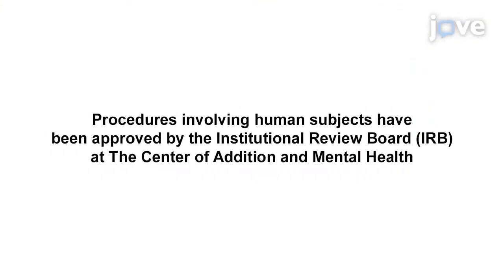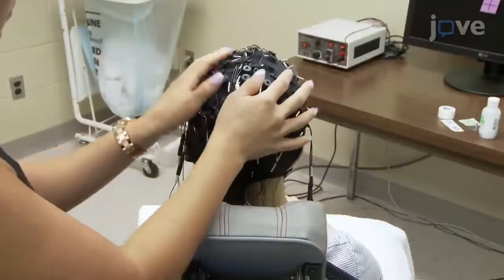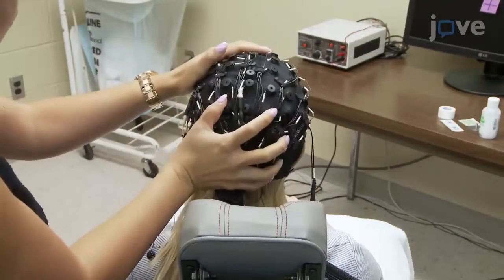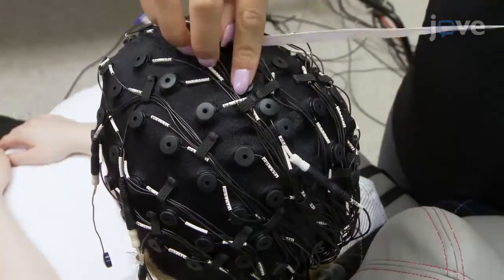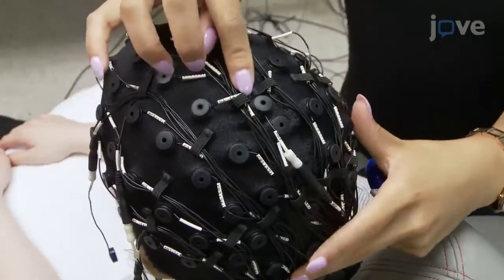Demonstrating the procedure will be Stacey's Sim, research analyst from our laboratory. To start, first choose a cap that fits the participant's head well. Place the CZ electrode at vertex, halfway between the line connecting the nasion and inion.